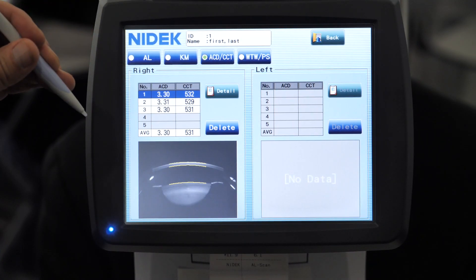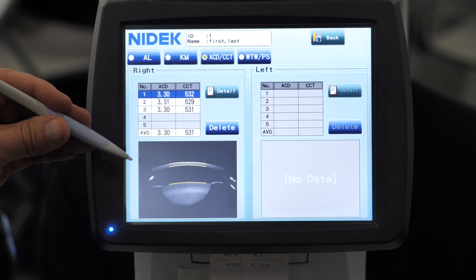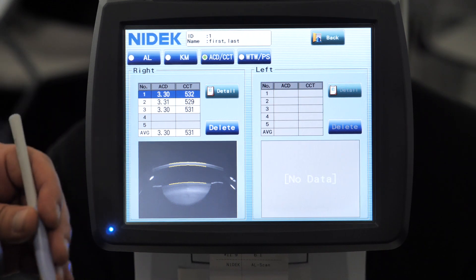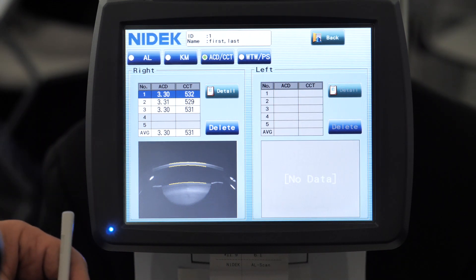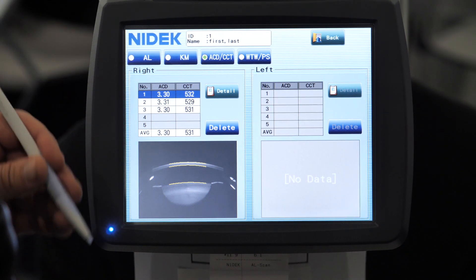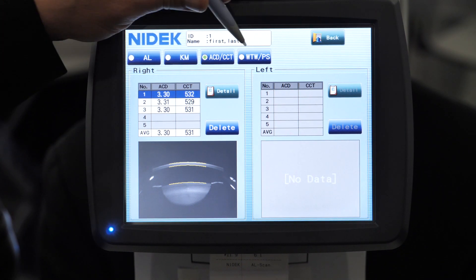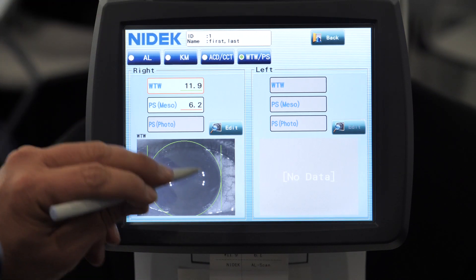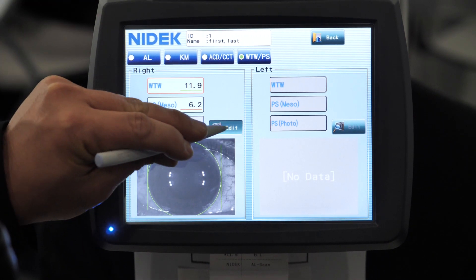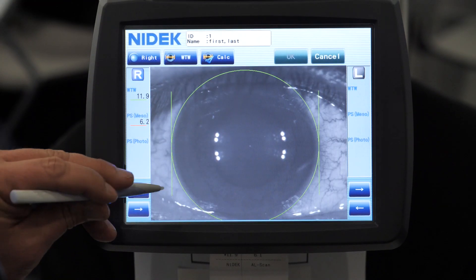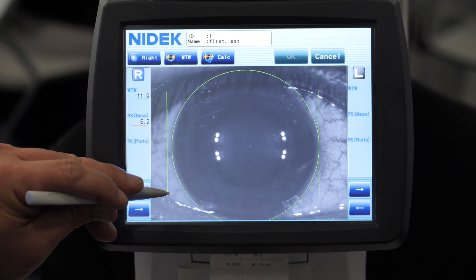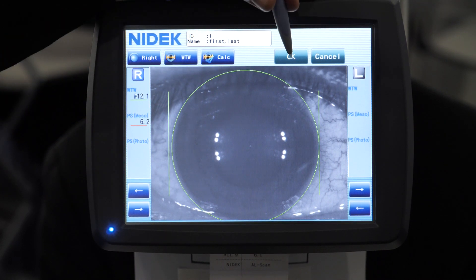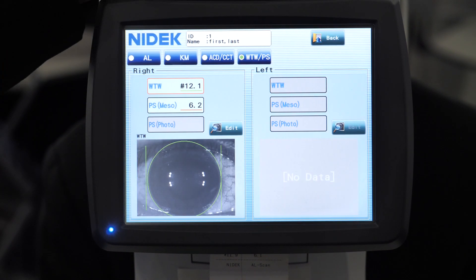For anterior chamber depth, we use Scheimpflug imaging, as you can see here. The reason we do that is because you get a more accurate anterior chamber depth measurement that way. And then for white to white and pupil size, on this screen here we can edit, we can move this out and about and recalculate if we needed to, and just select OK.